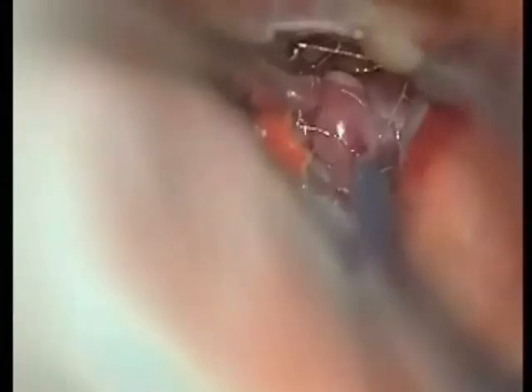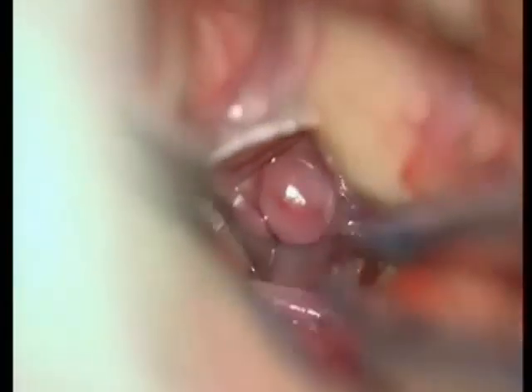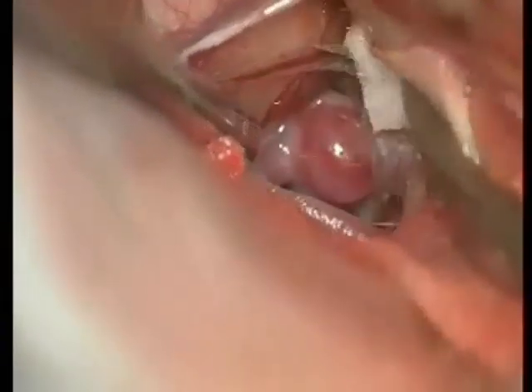Proximal M1 trunk behind and below the aneurysm is prepared for eventual temporary clip. The M1 trunk continues distally on the temporal side of the aneurysm. Some arachnoid bands are cut to open the sylvian fissure a little more, and the whole aneurysm base is cleared.